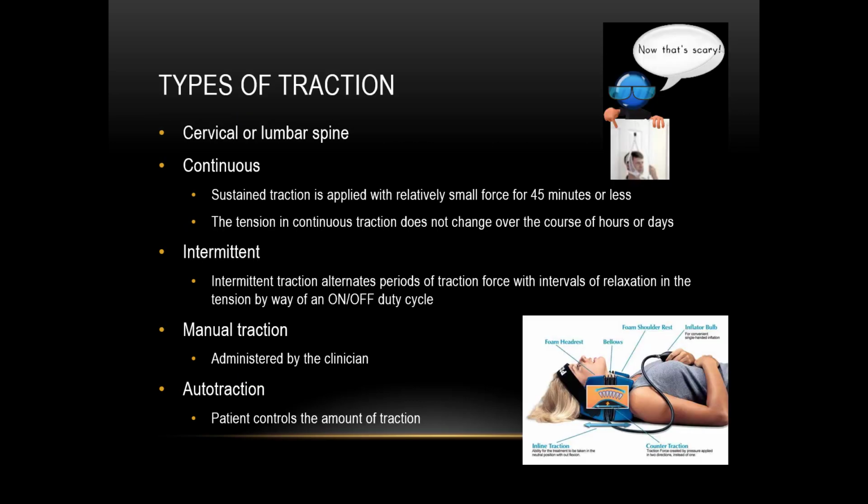The 2 primary types of traction are cervical traction and lumbar traction. Traction is indicated in conditions in which the patient's pain is caused by mechanical pressure on the vertebrae, facet joints, or spinal nerve roots, or other conditions in which removing mechanical stress results in pain reduction. Traction was previously prescribed in conjunction with immobilization and bed rest for spinal and back pain. The current uses of traction commonly emphasize the use of active exercise with traction to provide short-term mechanical relief of pressure placed on nerve roots, articular facets, and other structures.